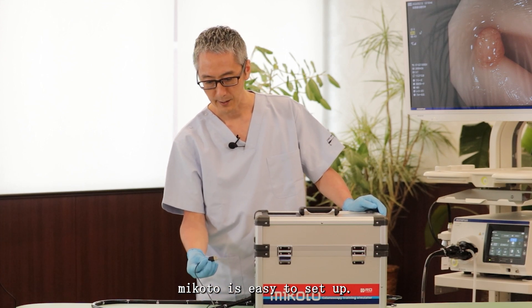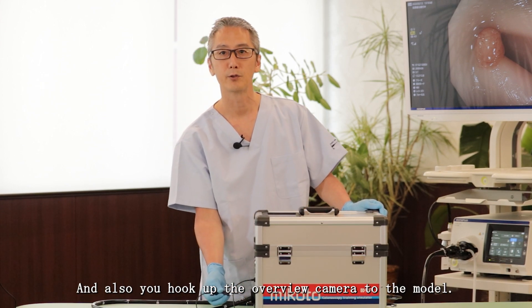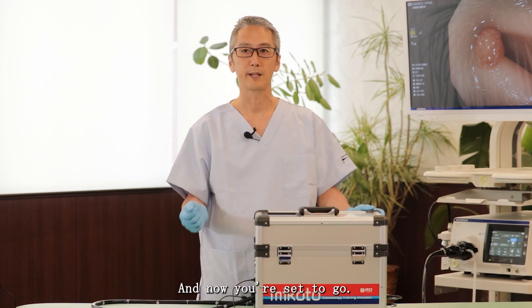Mikoto is easy to set up. You get the cabling from the endoscopy tower and hook it up, and you also hook up the overview camera to the model, and now you're set to go.